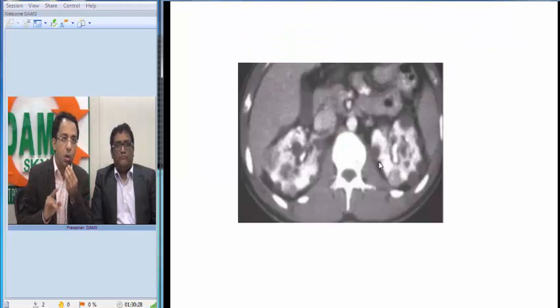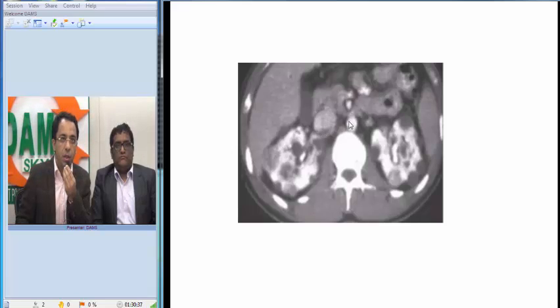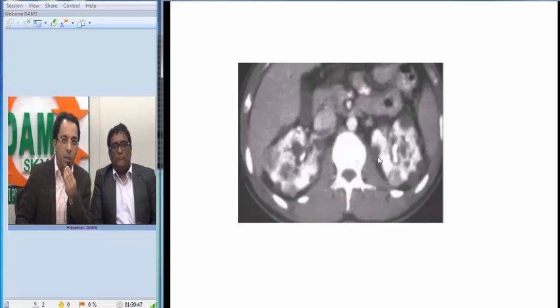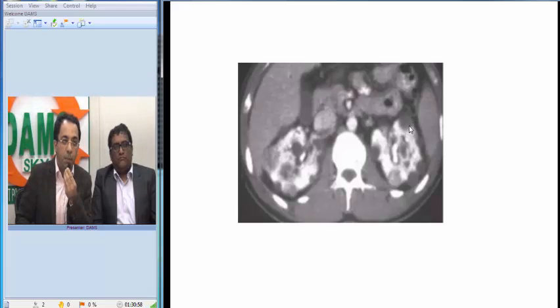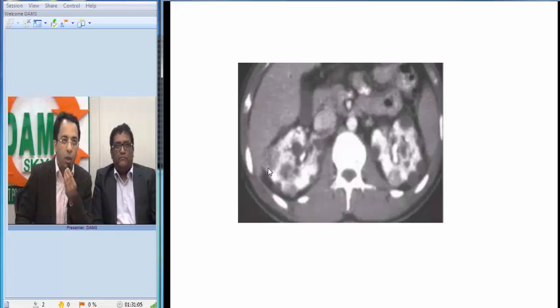Looking at this contrast-enhanced CT image, we can see the liver, part of the gallbladder, part of the pancreas, the inferior vena cava, and the aorta. Both kidneys show areas of normal enhancement after giving dye. However, there are multiple hypodense areas — totally dark, hypodense with no septae, imperceptible walls, and no internal contents. But there is one lesion with enhancing contents, and another lesion with thick solid septation and enhancing content.